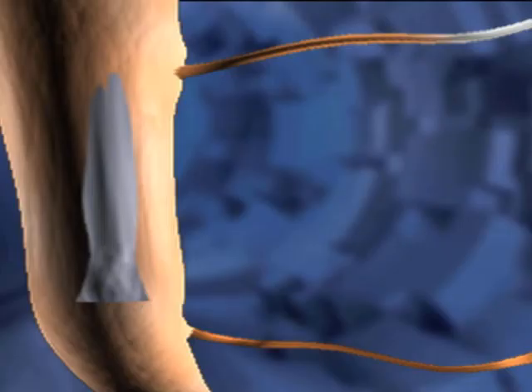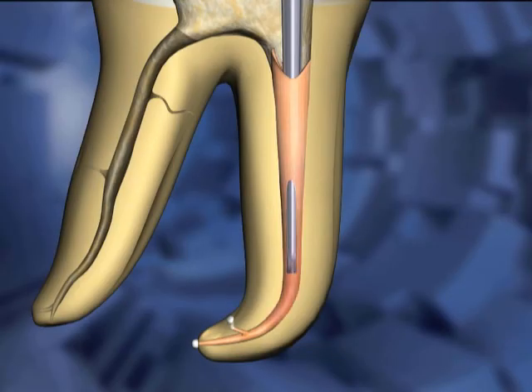After several seconds, when the carrier has reached its ultimate depth, a second one-second burst of heat is applied. One second later, as the carrier begins cooling, it is rocked side to side in the canal space.